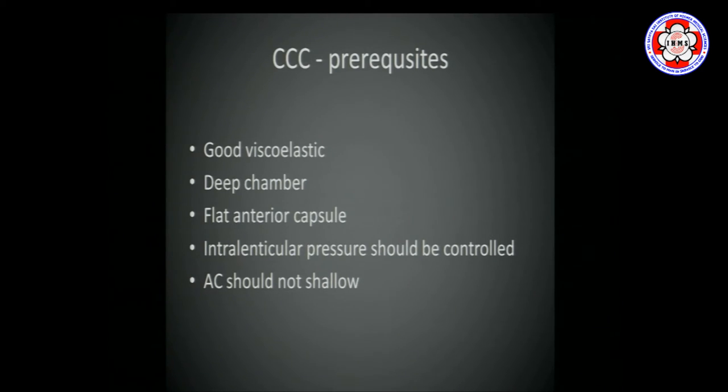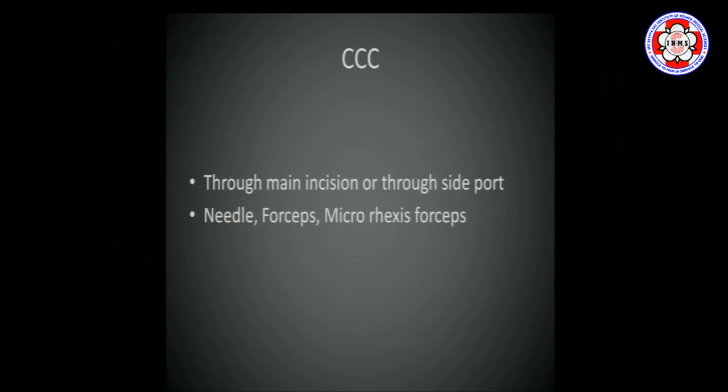It will be much better for a beginner — or even an advanced surgeon — to do the rhexis through a side port. You have multiple choices: main port or side incision. The main port will leak unless you are very experienced or have excellent viscoelastic. You can use a needle, a forceps, or a micro-rhexis forceps. That is the choice you make with experience. I prefer the needle, so all my videos will be with a needle.